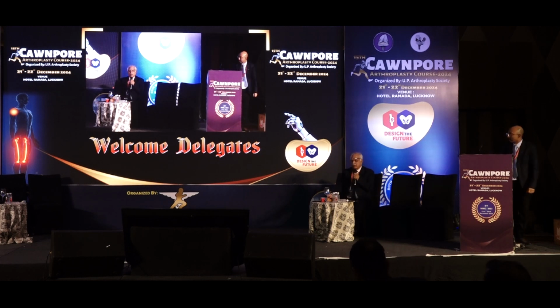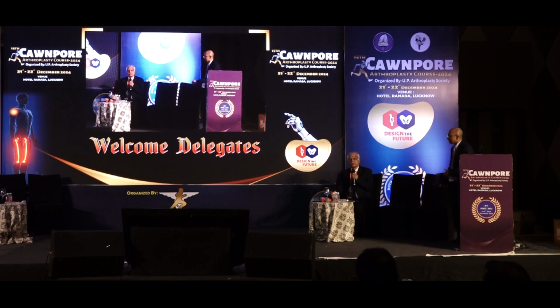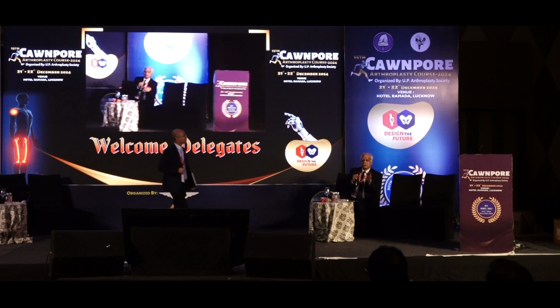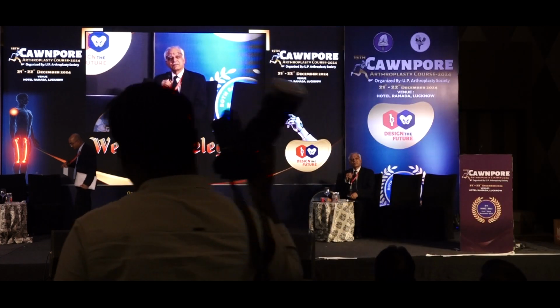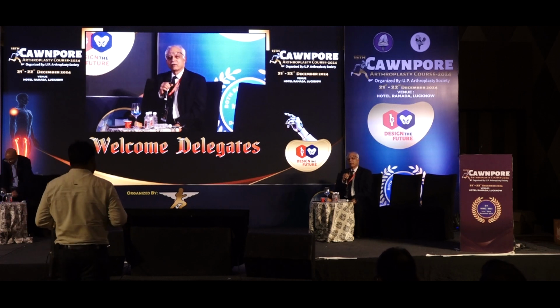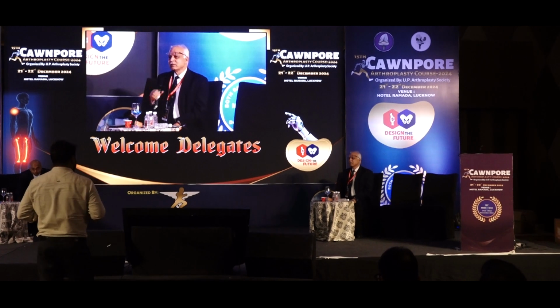So I think a lot of youngsters, and I used to have that inhibition to use a rod just to save money. But whenever you are in doubt, I think, in joint replacement surgery, that's one lesson you must learn: overdo it. Don't think God will help you. God doesn't help you. Okay, so next.